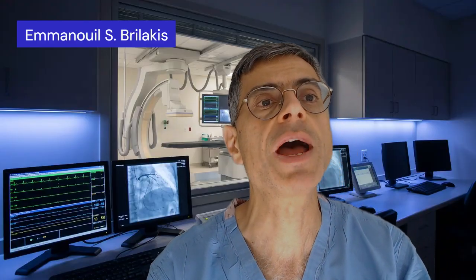I think virtual PCI can play a big role in the first part, which is to plan our procedure and see if we can plan it so as to have an excellent or as good as possible post-PCI physiology measurement. But maybe you can give us your thoughts on this. How often do you do post-PCI physiology? We now have angiographic physiology as well, which can simplify this. How often do you do this, and have you found this useful?